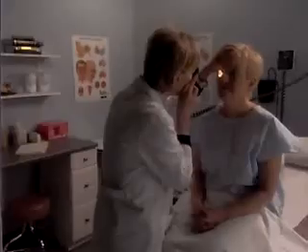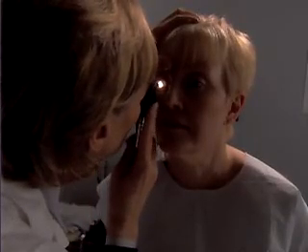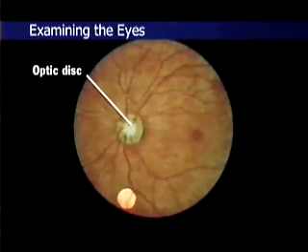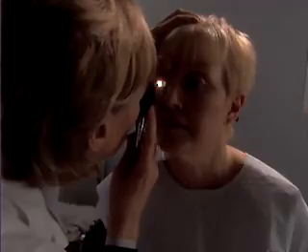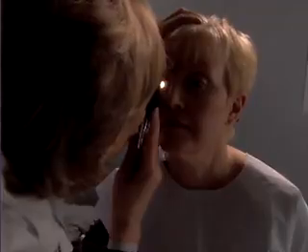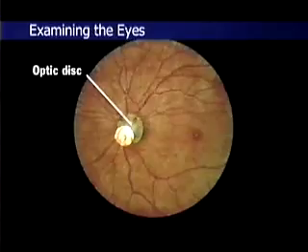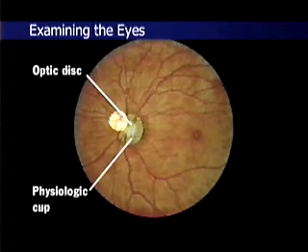While holding the red reflex in view, approach the patient's eye along a 15-degree line lateral to her line of vision until the ophthalmoscope is close to the eye. Try to find the optic disc by following the retinal vessels centrally toward the place where they converge. Now, using your index finger, bring the optic disc into sharp focus by adjusting the diopter of the ophthalmoscope. Note the color of the optic disc, the clarity of its margin, and the size of the physiologic cup.